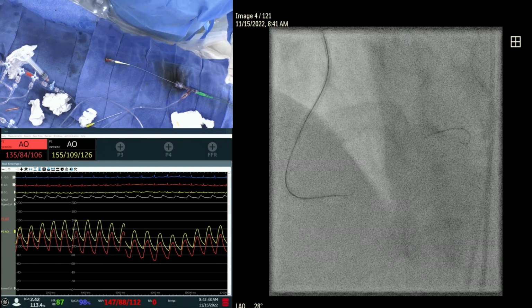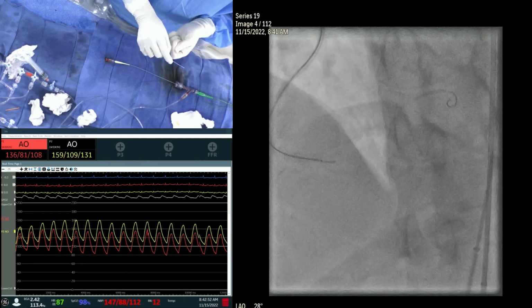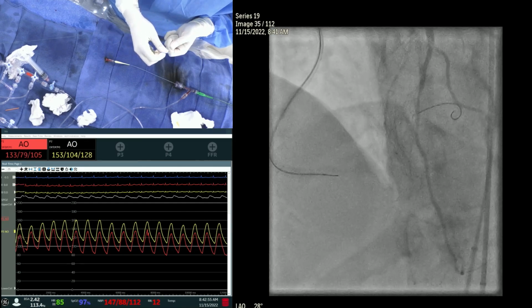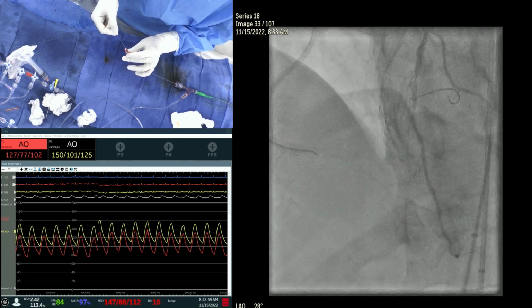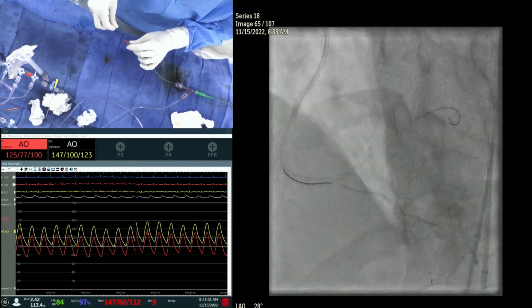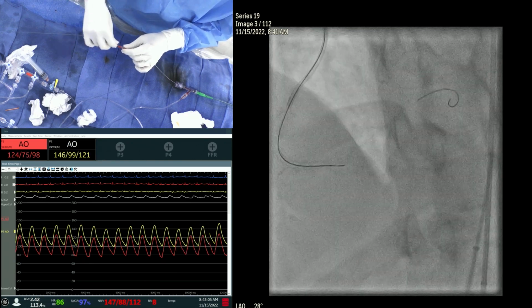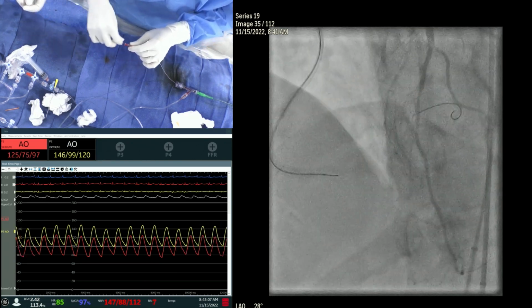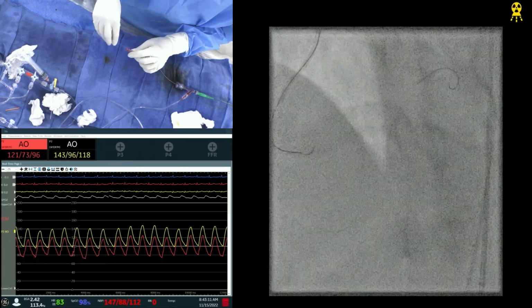You can see here, we saw that earlier, filling up the PDA up to the ostium. See that? And now we did not. That means our wire is there at the ostium. See that? Yeah. Occluding the, yeah, maybe. Yes. Do you have the confidence already? I'll go with the whisper first. Okay.